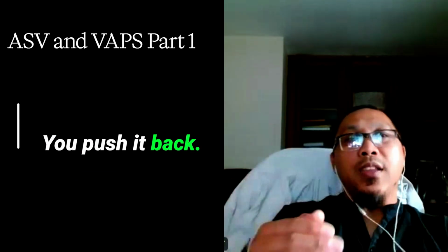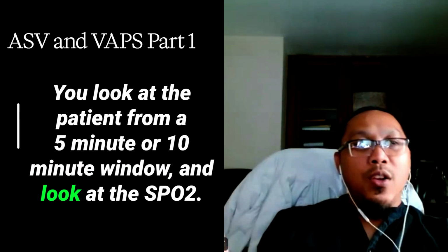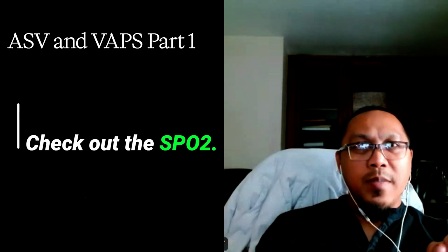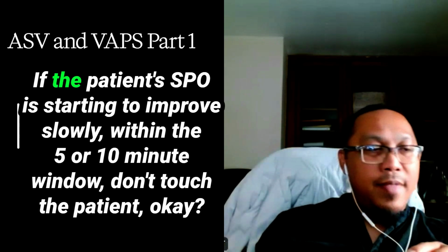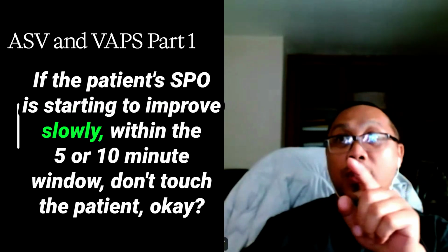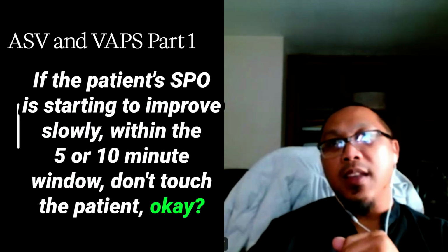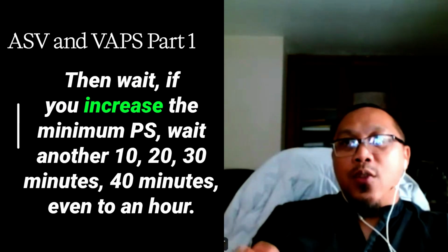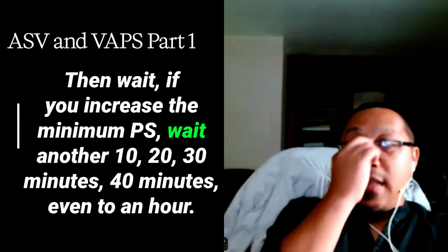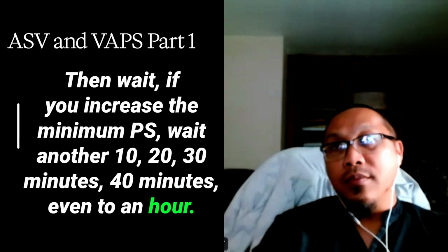You push it back. You look at the patient from a 5-minute or 10-minute window and look at the SpO2. Is the SpO2 still a cyclical pattern? Leave the patient alone. If the patient's SpO2 is starting to improve slowly within the 5 or 10-minute window, don't touch the patient. Okay. Then wait. If you increase the minimum pressure support, wait another 10, 20, 30, 40 minutes, even an hour.